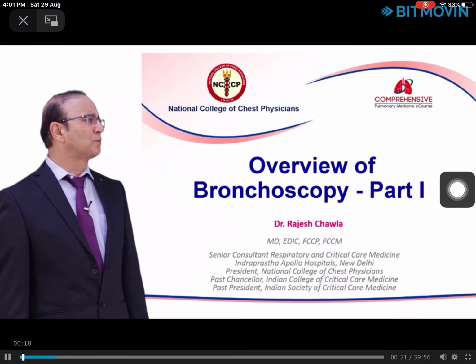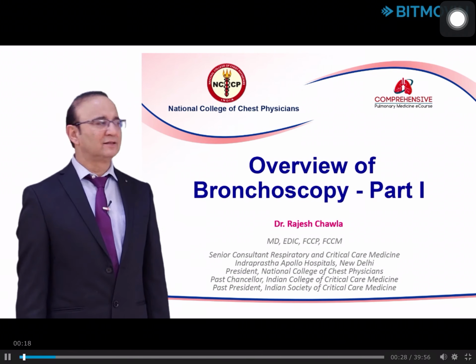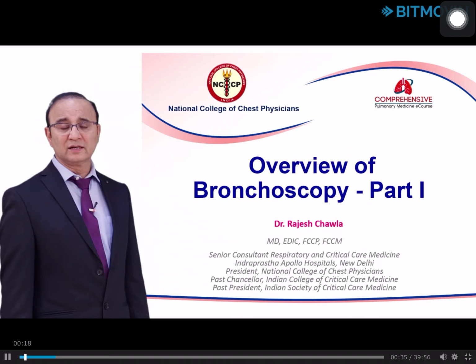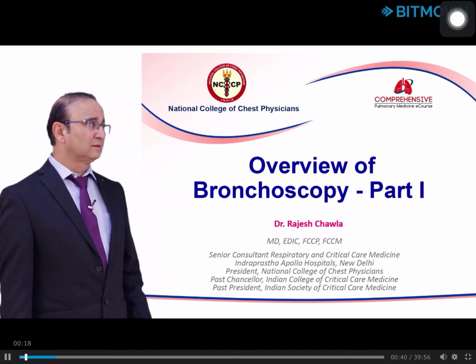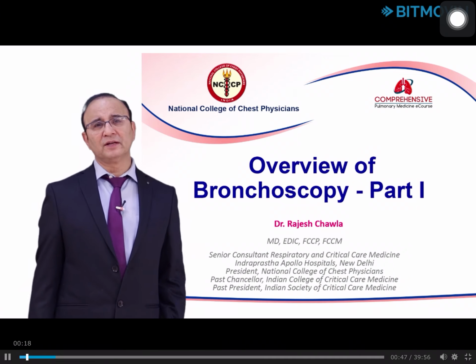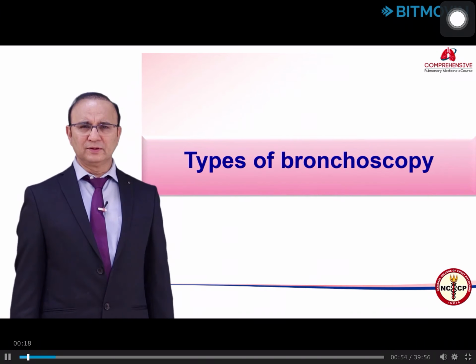Bronchoscopy is an endoscopic procedure that visualizes the tracheobronchial tree by placing an optical instrument inside the lung. The value of bronchoscopy has really grown in its diagnostic and therapeutic capacity over the last 2 decades, and the clinician needs to be aware not only of the technology, but should also be well aware of the associated clinical applications of bronchoscopy. So, what are the types of bronchoscopy?